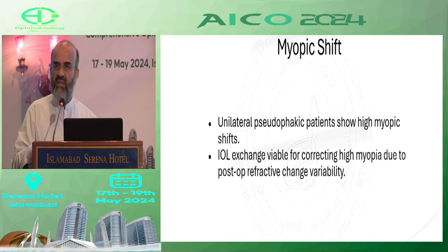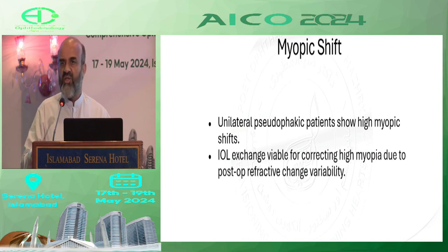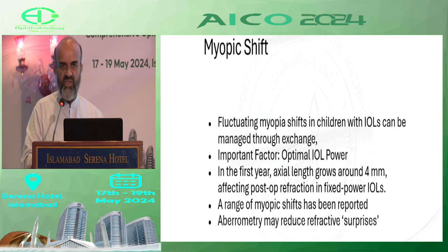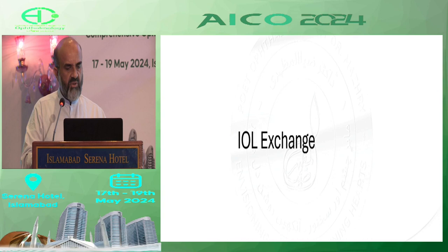The chances are that both of the eyes will be seeing because of their different near far points. So my tendency is to implant the IOL at any given stage and then wait for the myopia to occur, and when it reaches about 10 to 12 years of age, you consider pediatric IOL exchange. So this was the background discussion.